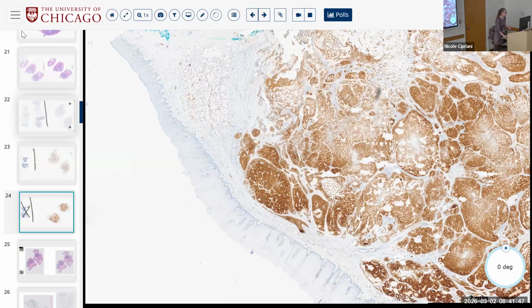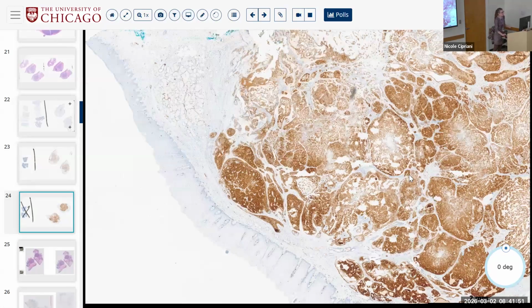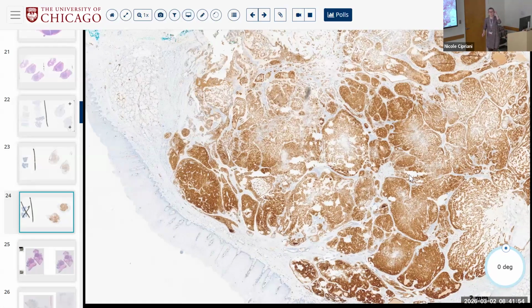If you were uncertain, what kind of mutation or fusion would you be looking for? PRKD1 mutation or fusion, exactly. I believe this had the fusion. So we're like, okay, I don't know what those P40 positive cells are doing there. Morphologically, this is polymorphous. The P63 and the P40 are a mismatch, and the S100 is diffusely positive.